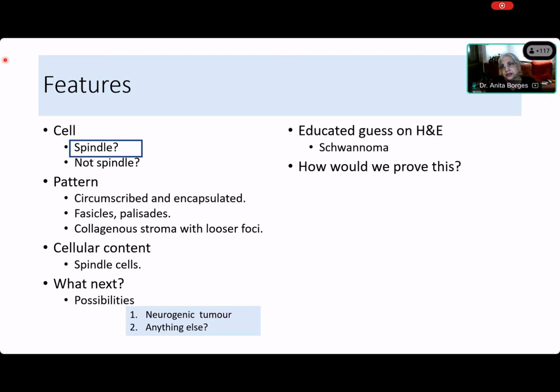Come on, Saida, what? It will be highly cellular and with increased mitotic activity. Very good. Exactly, and it should have necrosis. And there is nothing like that over here. There's no mitotic activity, there is no necrosis, and it is not highly cellular, and it is beautifully palisaded. Okay? Yeah, so I don't think that this is a malignant peripheral nerve sheath tumor.